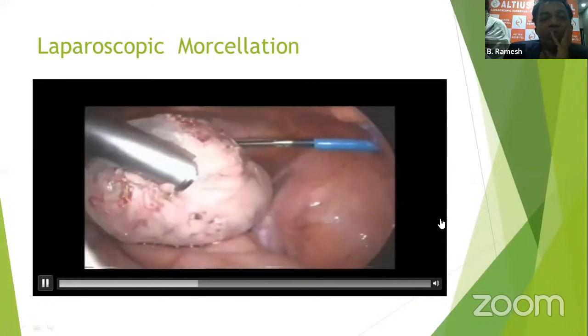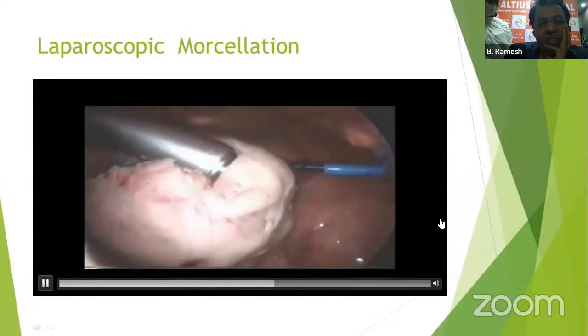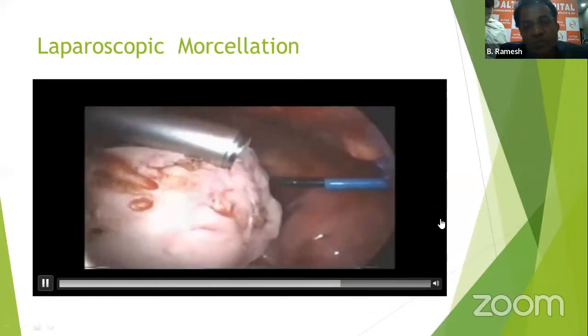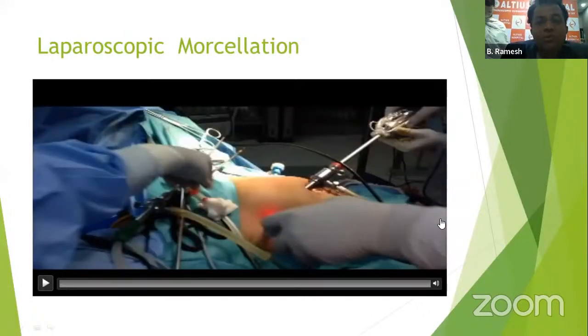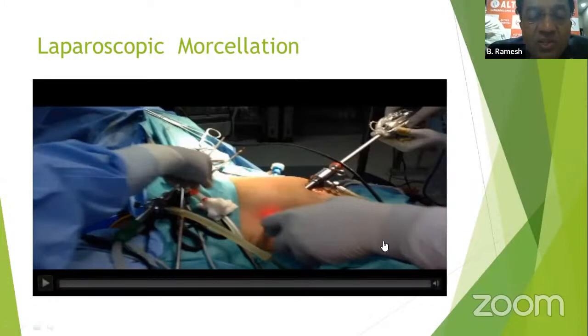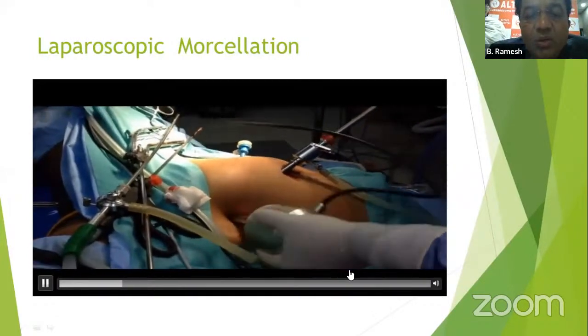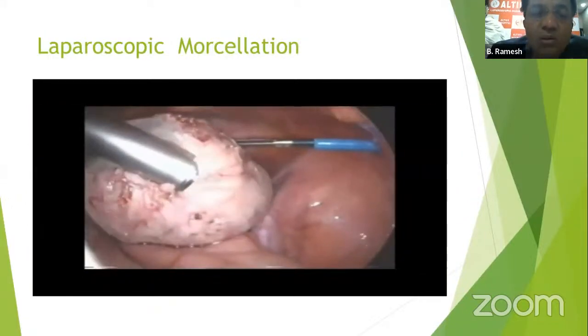So now this is the example of laparoscopic morcellation, wherein you can take large chunks of tissue. This is called ribbon resection or ribbon morcellation, where you can see the entire fibroid can be done within 1 or 2 strips. So we preferably use it for the larger uterus, but our first preference is vaginal morcellation. The second preference is laparoscopic morcellation combined with vaginal morcellation.